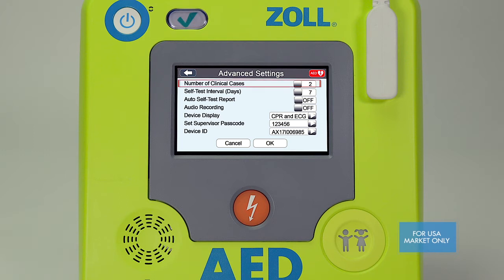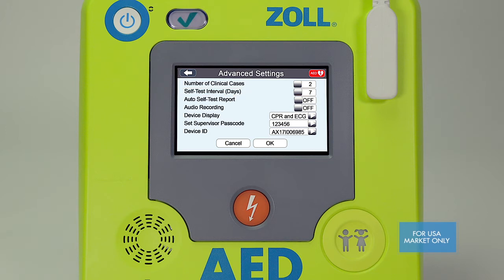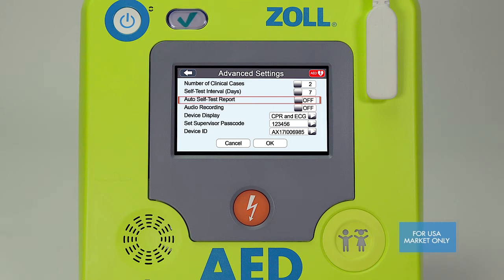The AED3 BLS stores up to two clinical cases and can do self-tests either weekly or daily. We recommend that the default settings of saving two clinical cases and weekly self-tests be left as they are. Storing two clinical cases helps reduce the potential of accidentally writing over case files, and weekly test intervals conserve battery power. If you're not using the automatic Wi-Fi feature to transmit device status to your program management software, you should disable this by turning the auto self-test feature to off. If you are transmitting to program management over Wi-Fi, you should enable this feature by selecting on.